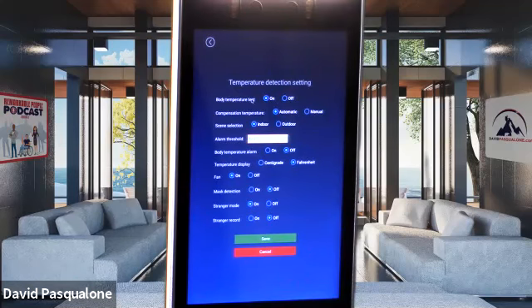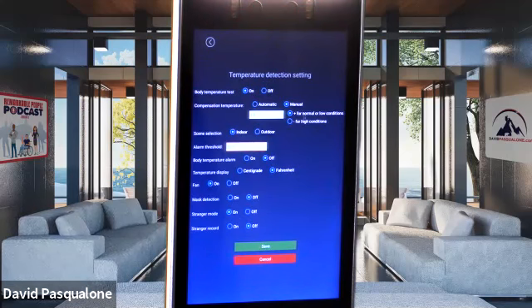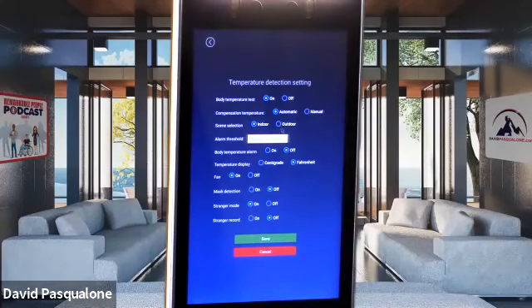So in the body temperature settings, the first thing is you set to test, yes or no. So we have that on because we want to see what someone's body temperature is. Compensation temperature we have set to automatic. Now you can go to manual and go for higher or lower conditions. So if you're in a cold climate or a high climate, you can actually adjust the temperature slightly so the unit is defaulted and it acclimates quicker manually. However, for most people, indoor use automatic is perfect and all you need.